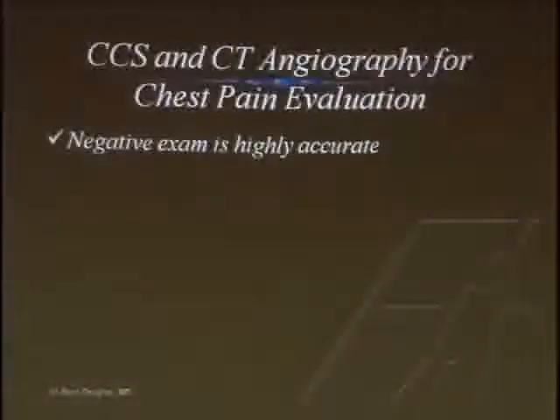Okay, what I'm going to try to drive home is that this test, when it's negative, is extremely accurate. I already told you, forget about CT angiography. If I tell you your calcium score is 0, I can exclude significant disease better than any other non-invasive diagnostic test we have. A calcium score of 0 has a higher negative predictive value than the stress test does. Now I'm going to add my coronary CT angiogram and give you another test with an incredibly high negative predictive value. So you're going to get 2 tests here that we're going to talk about.